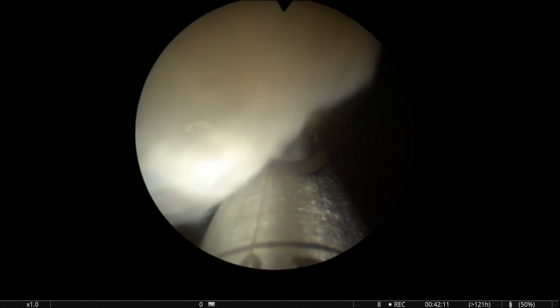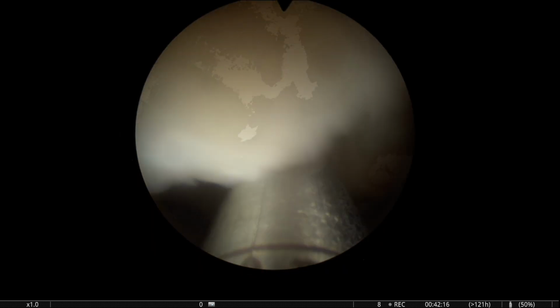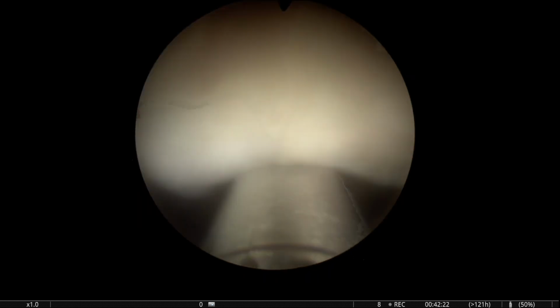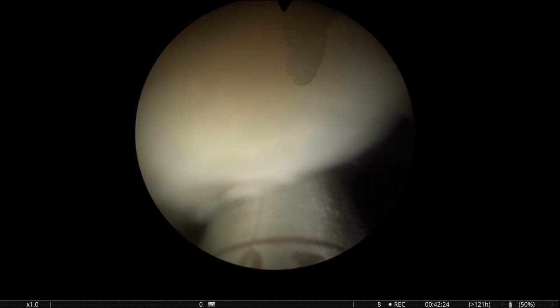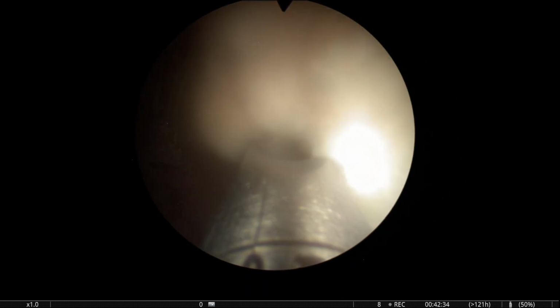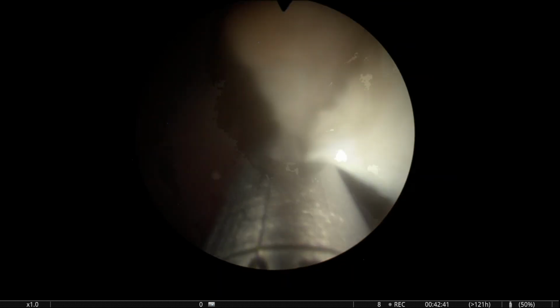I think the apical dissection has been very well standardized, and maybe you can open the bladder neck a little bit earlier and then complete the lateral and posterior dissection, or you might try to make a better dissection of the lateral and even posterior before opening the bladder neck. These are optional things, I think, that everybody probably will do differently.